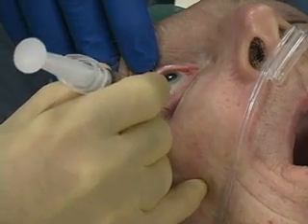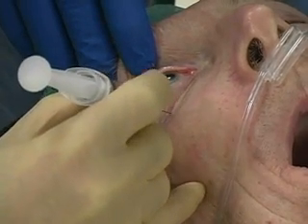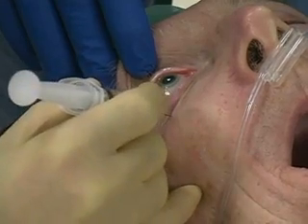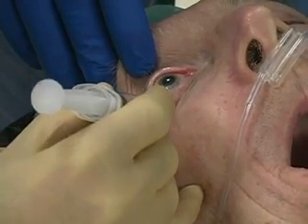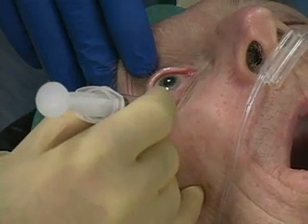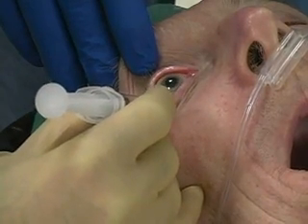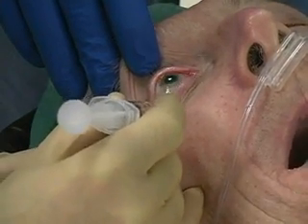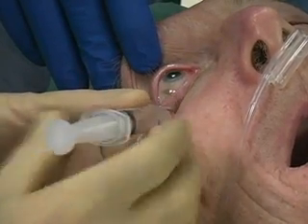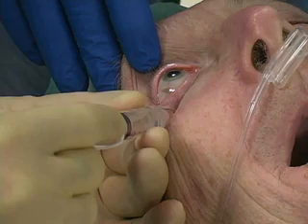Advance the needle until you hear, and possibly feel, a distinct pop. This indicates you have passed through the orbital septum. Redirect the needle medially and superiorly toward the apex of the orbit until a second pop is felt. The second pop occurs as you pass through the sheath surrounding the orbital muscles and into the muscle cone.